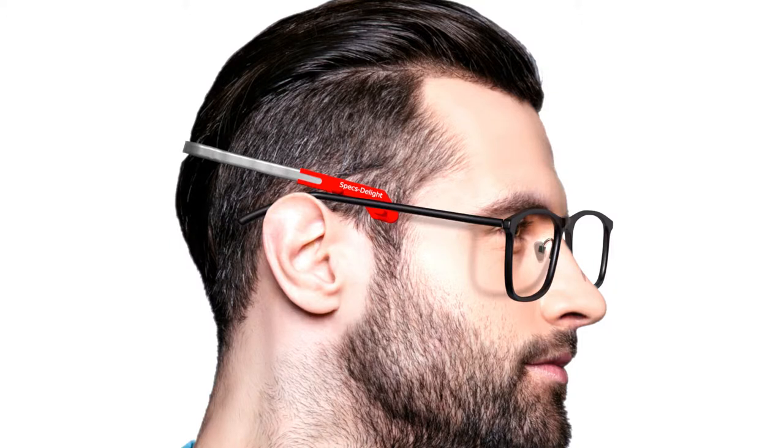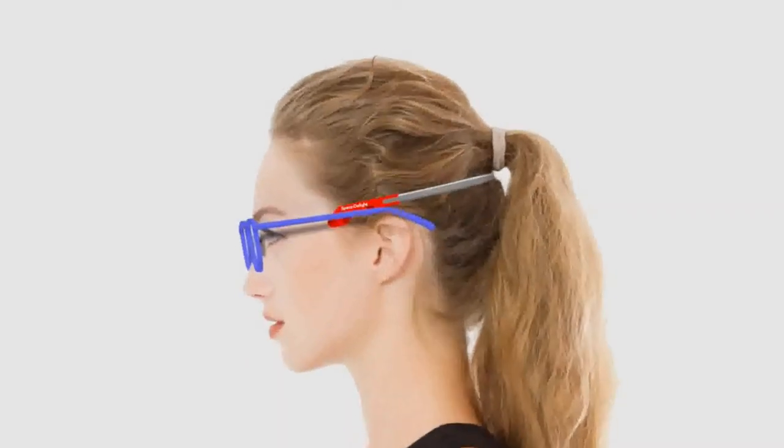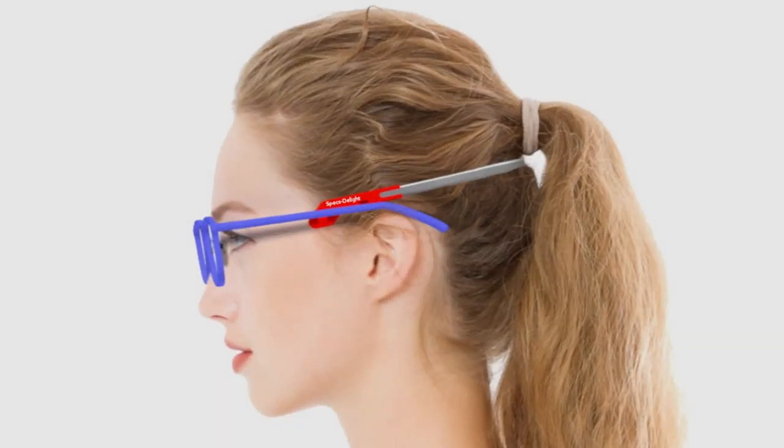So the Spexty Light isn't just for rhinoplasty. I haven't had rhinoplasty or any nose injuries, but I wear the Spexty Light as a routine simply because I like to experience the bliss of wearing my glasses off my nose and ears. And you could easily do the same.